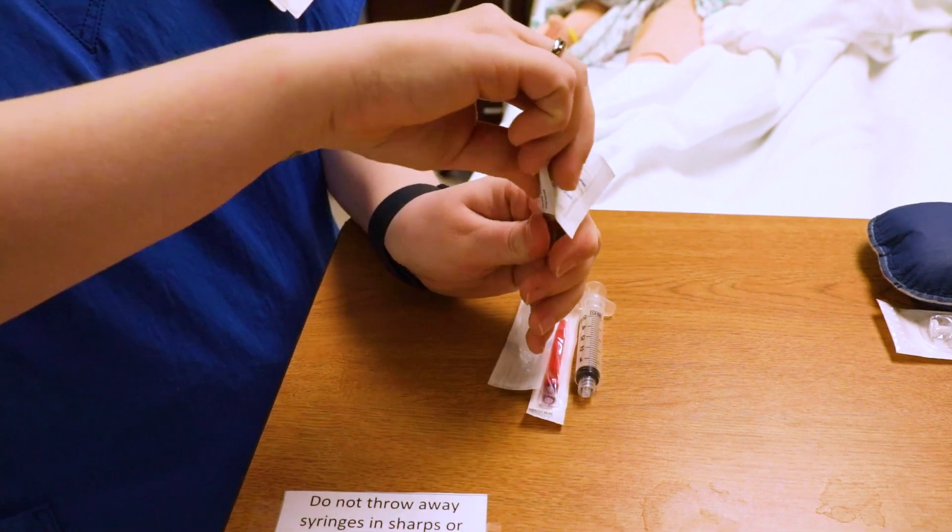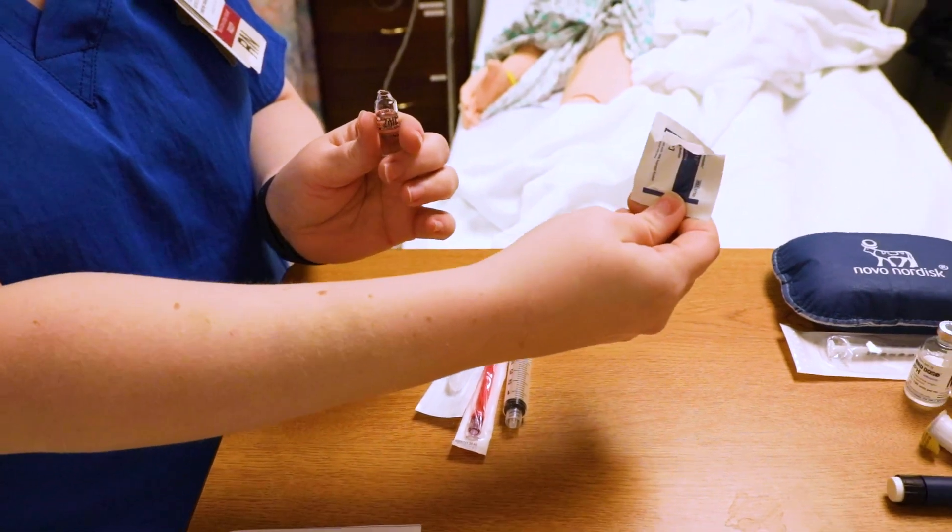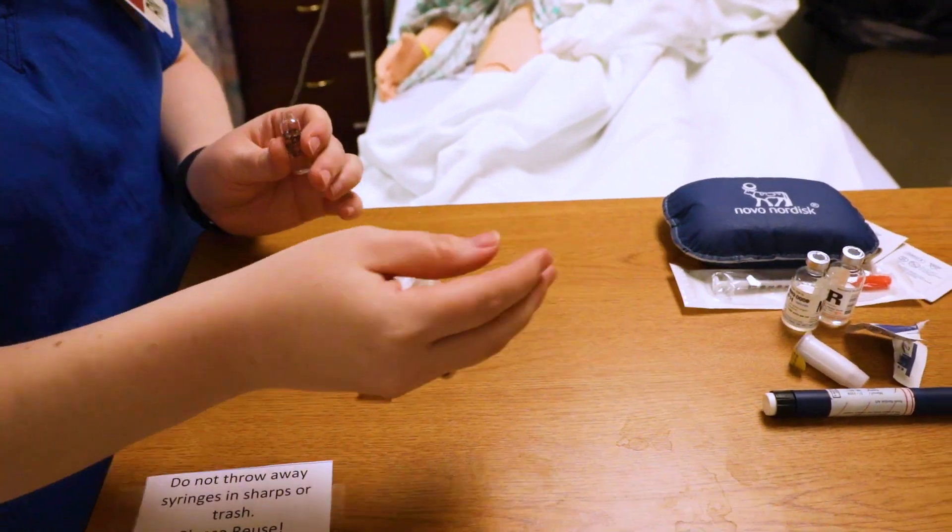Always break glass away from you, never towards you. So as I push it, I pop it like that. The top needs to go straight into your sharps container — so we got rid of that in the sharps container.